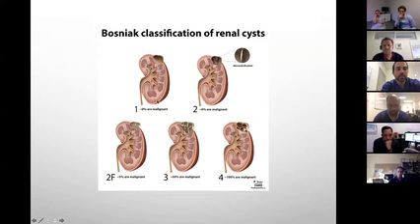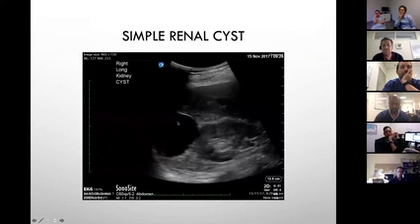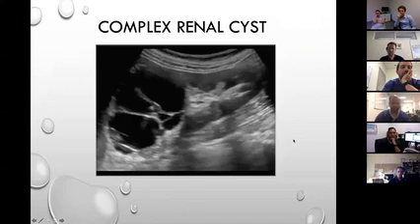But size doesn't matter, at least in one place. It doesn't matter how big the cyst is. It's not classified based on the size of the cyst. It's about the architecture. What do you think about this one? Very clean-looking cyst. There's a bit of a shadow, ignore that. There's no septation, so it's always a single simple cyst.